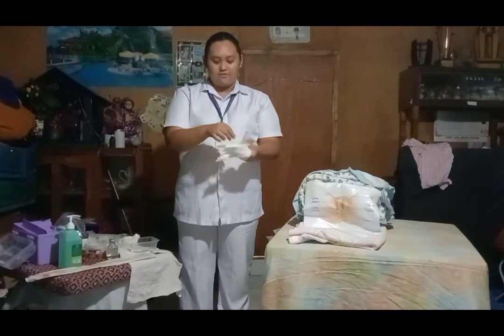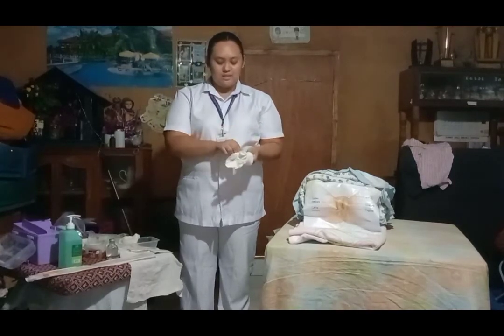Open the set, observing sterile technique. This is to ensure that all the equipment needed is free from any microorganisms and kept sterile. As you can see, I already opened the catheterization set, and it's already sterilized. Then I'm going to put on my sterile gloves. This is to prevent the spread of any microorganisms present.